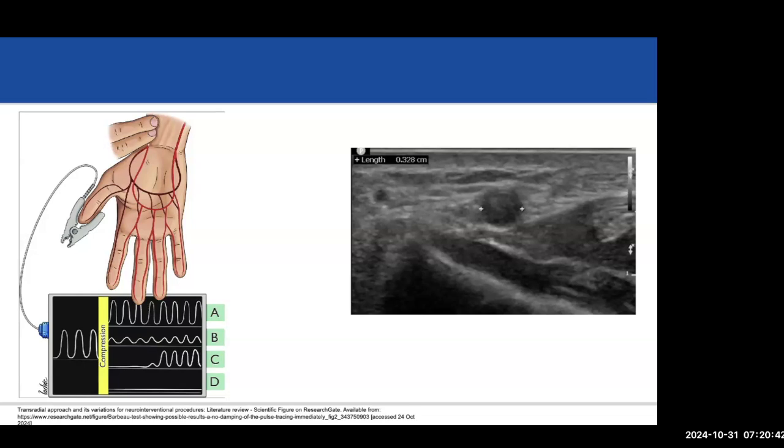And for the femoral access, we highly use it because of the larger caliber. However, the disadvantage is if we encounter an emboli and it's dislodged, then there's a risk of ischemia. That's why after the procedure, when we look at our patients, we need to check the femoral as well as the dorsalis pedis artery.